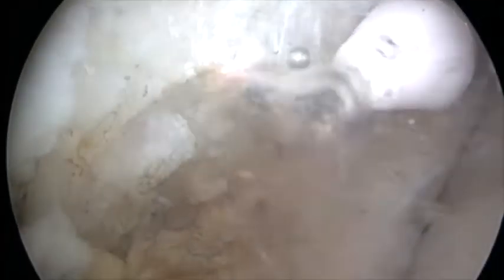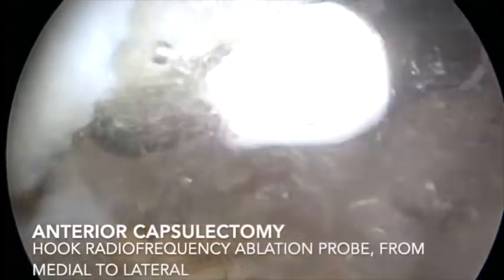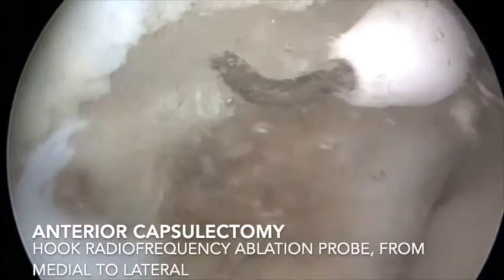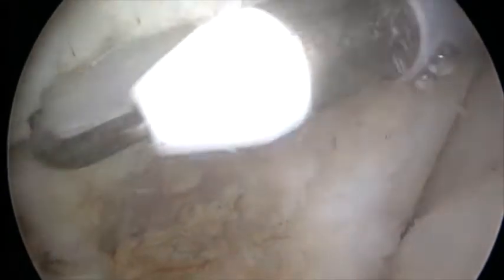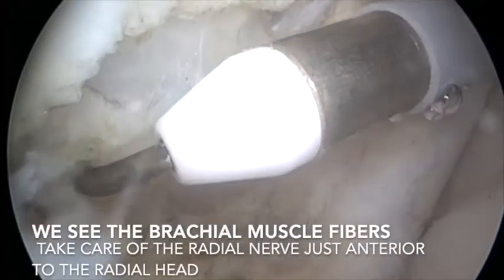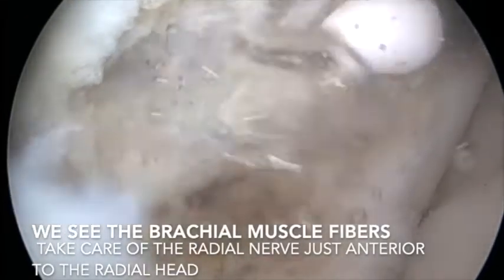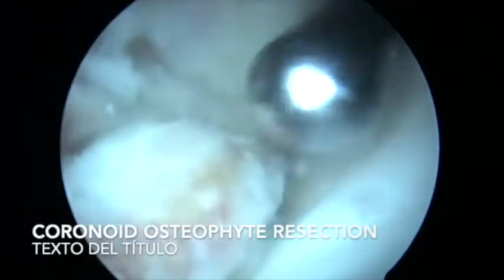Then we used a hook radiofrequency ablation probe to perform an anterior capsulotomy. This is a very useful device because you can control the tip of the resection of the anterior capsule very well, until you arrive at the muscle fibers of the brachialis muscle.